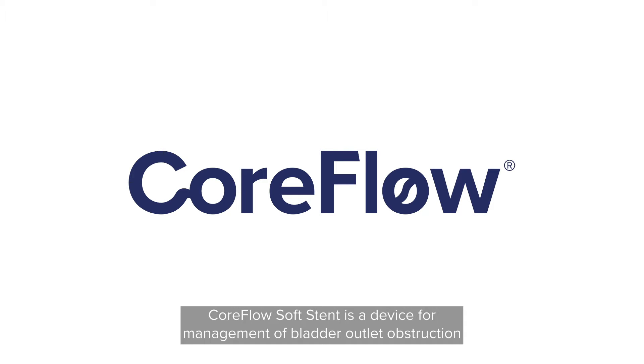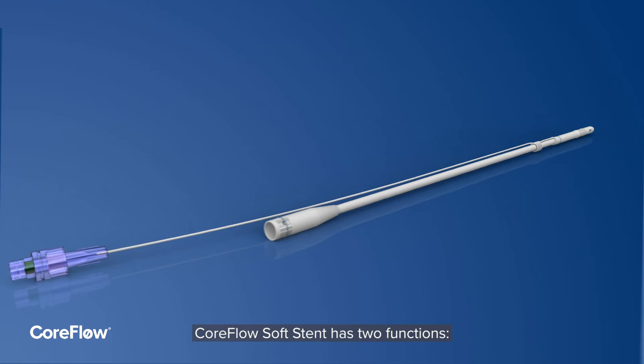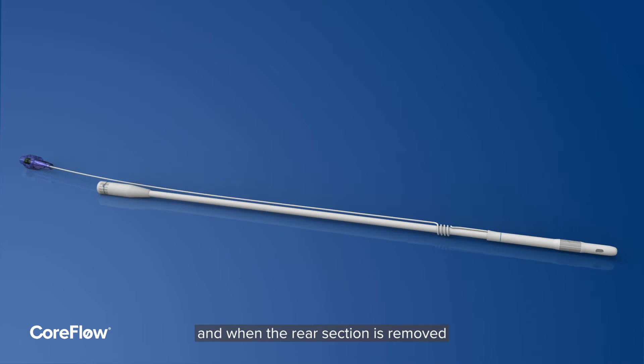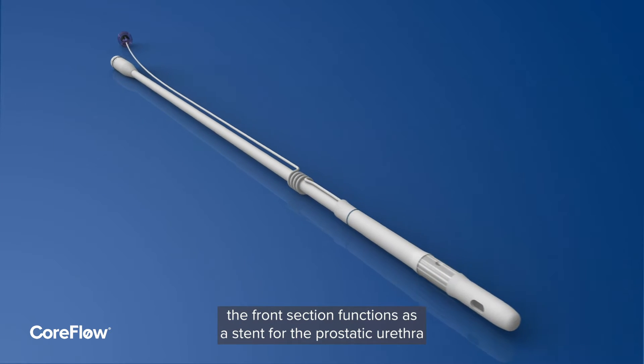CoreFlow Soft Stent is a device for management of bladder outlet obstruction. It has two functions: it works as an indwelling catheter, and when the rear section is removed, the front section functions as a stent for the prostatic urethra.